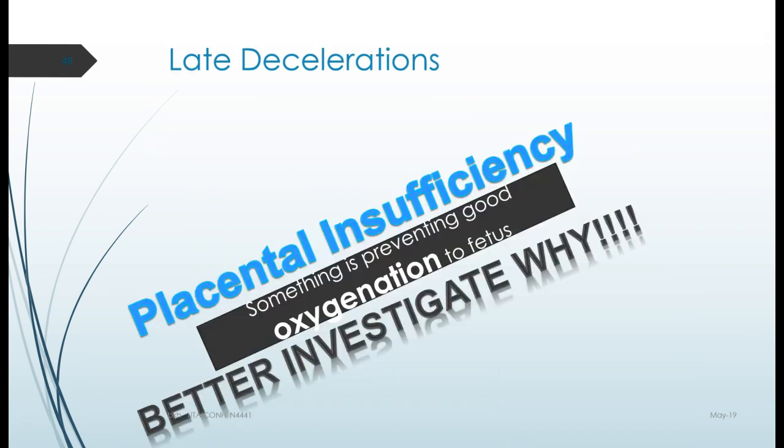I'm going to give you a hint on how to remember these in a minute. Just walk with me through these and get these understandings, and then I'm going to show you an easy way to remember these.